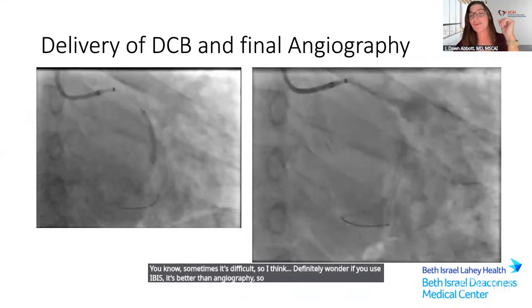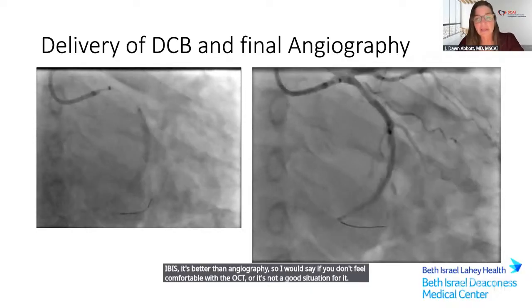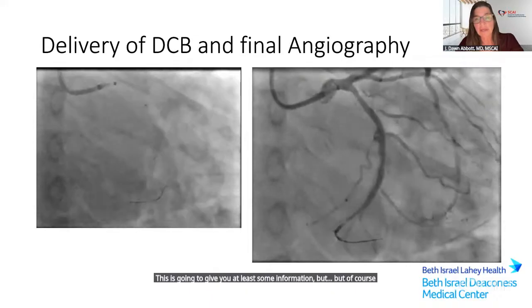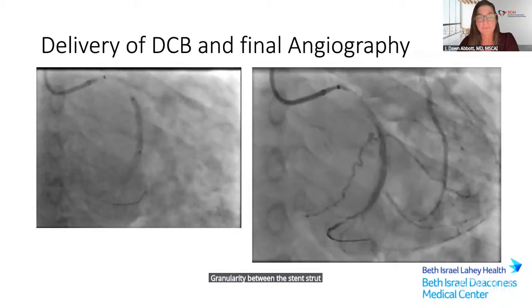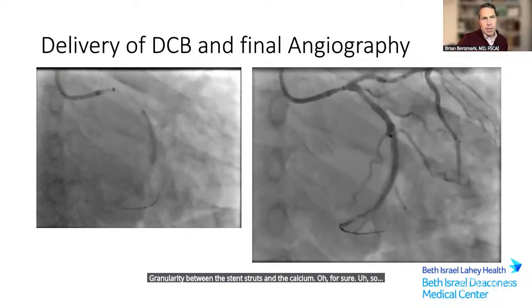So I would say if you don't feel comfortable with the OCT or it's not a good situation for it, IVUS is going to give you at least some information, but of course, it's not going to give you the calcium depth, and it's not going to give you the granularity between the stent struts and the calcium, for sure. Definitely, point well taken.